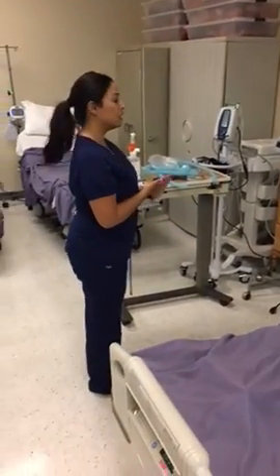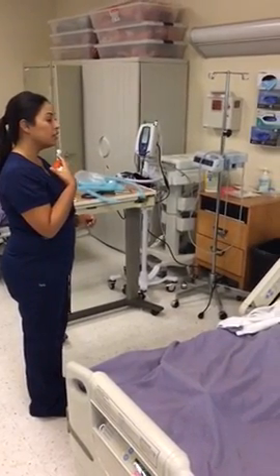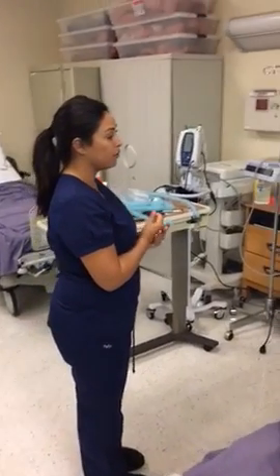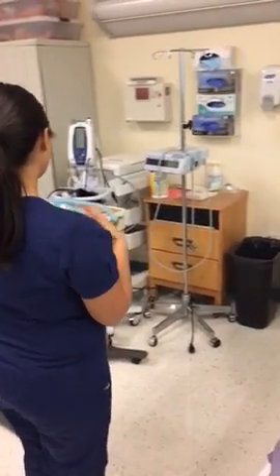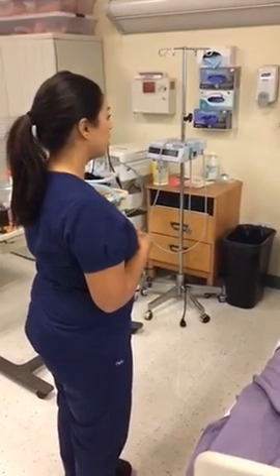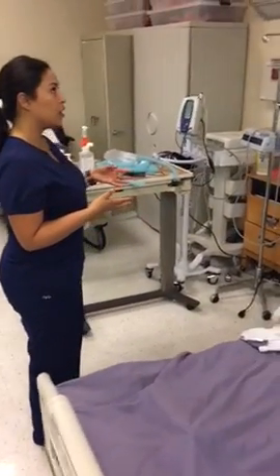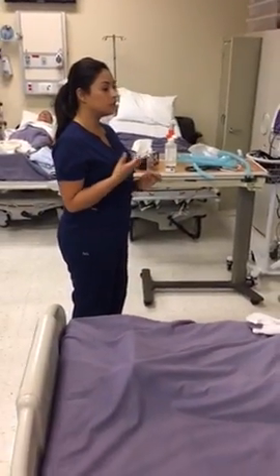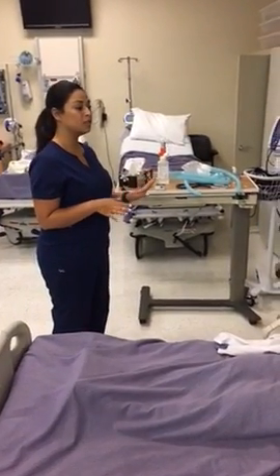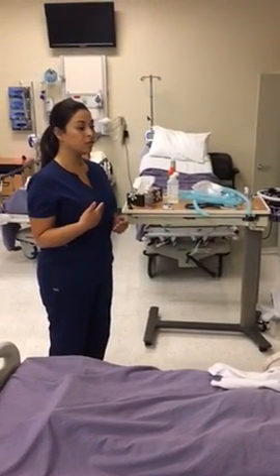So what I'm going to be doing today is adding some humidity to your oxygen. I understand you have a little bit of swelling, and there's some secretions that need to be loosened. That way you can cough them out. Some complications that could arise with humidification would be that the tubing could get bacteria in there and get contaminated, or there's a chance for overhydration, but I don't anticipate any complications, and we're going to do our best to avoid those. It should make you feel a lot more relaxed and improve your work of breathing.